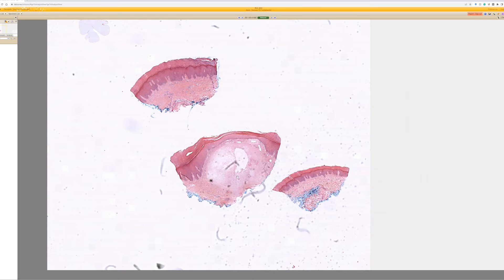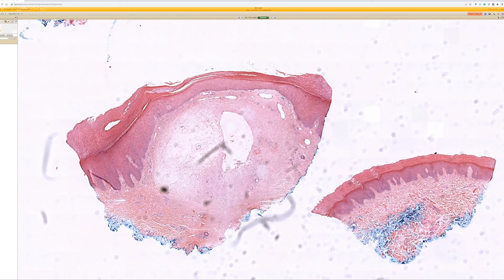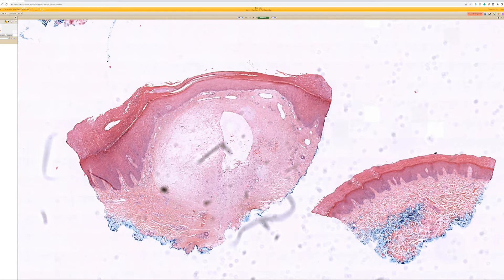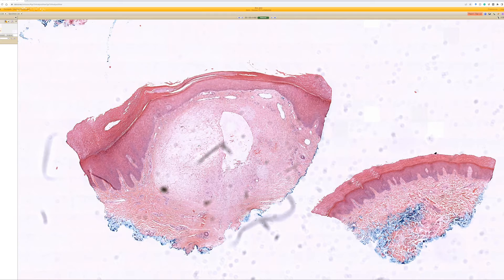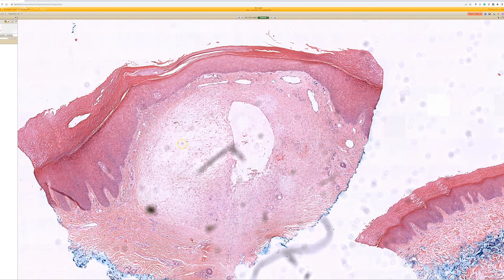All right, first glance, really thick and compact stratum corneum, so likely on an acral site. And especially in this left piece here, you can see this cleared out area. It kind of looks to be cystic.